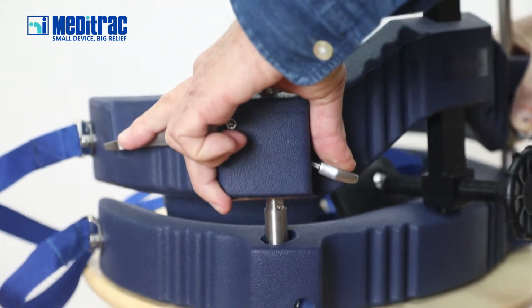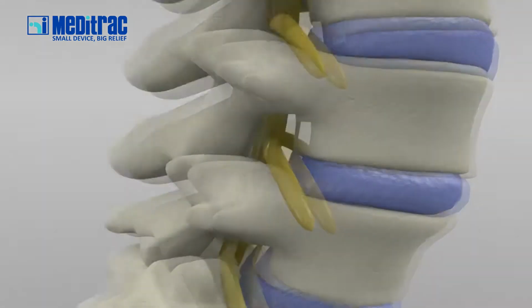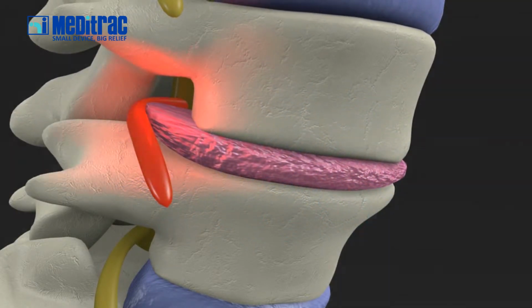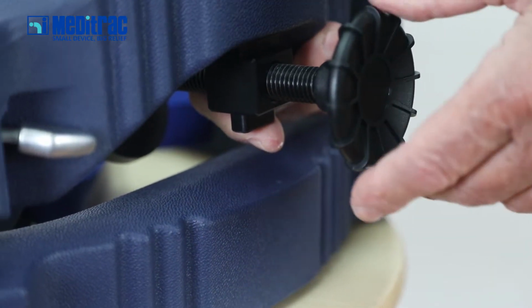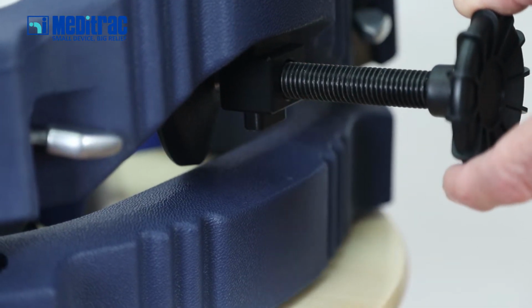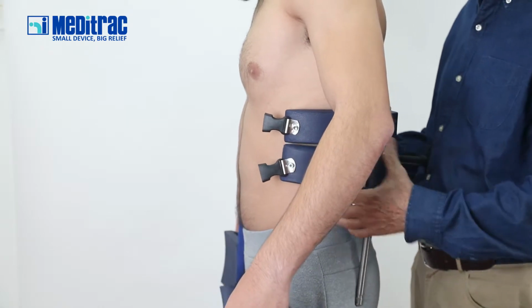Begin with the Vertetrac in the 0 position by inverting the Vertetrac unit on a horizontal surface and pressing the traction release levers and bringing the upper frame and lower frame to their closest possible position. Retract the horizontal pressure pad fully by depressing the screw release button and pulling the horizontal force screw. Place the Vertetrac on the patient's body.